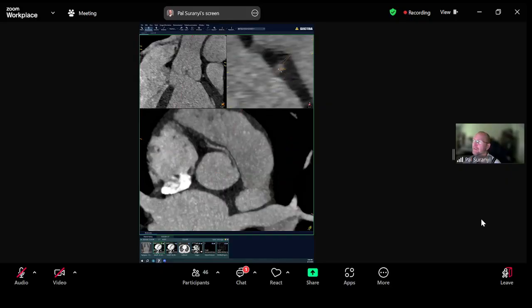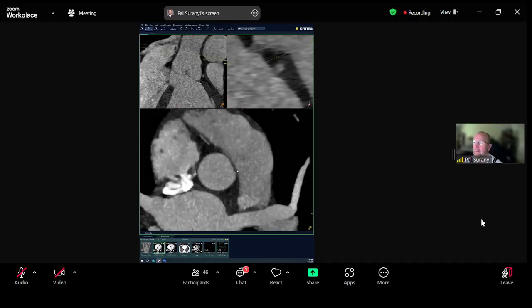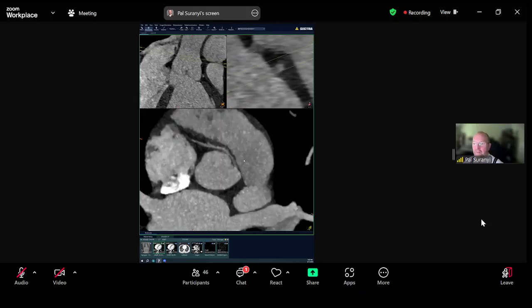Oh, I can't even. You guys get the idea. So it's a little bit wider this way than in this direction. So it becomes ovoid in that sense and narrowed, as it's not only interarterial, but also intramural proximally.